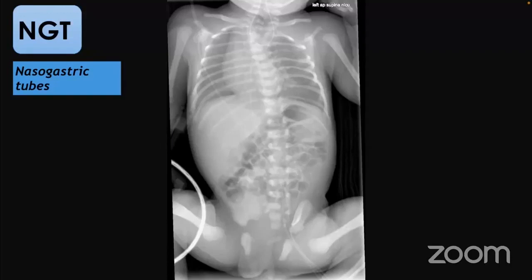And we have as well a gas-filled pouch in the upper part of the babygram. And also, if you take a look at the upper part of the spine, the proximal part of the dorsal spine, we have segmental anomalies in the vertebrae.